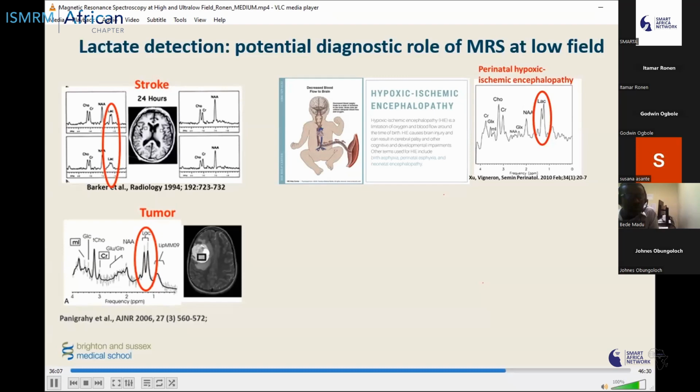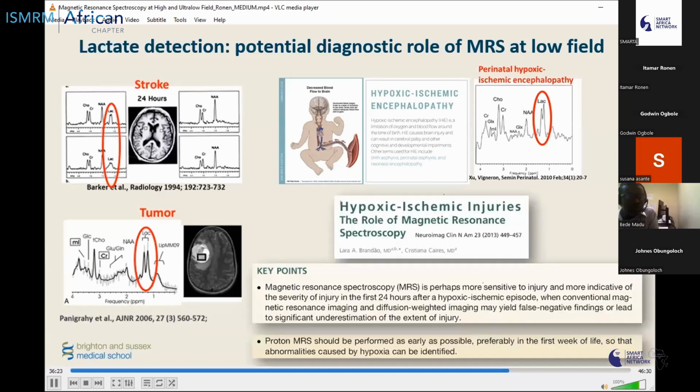And this amount of lactate is high enough to detect. And not only that, but lactate becomes a very important marker, not only for the degree of pathology of those babies, but also for the prospects of their healthy development later on, as mentioned, for example, in this particular quote that you can see here down below.